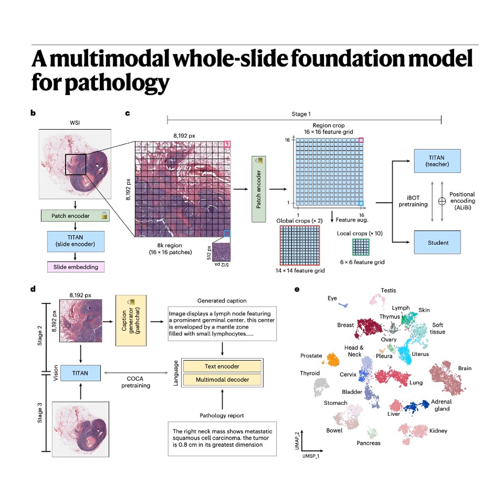Across a whole suite of subtyping tasks, Titan showed an average performance increase of plus 8.4% over the next best model. In clinical AI, that is a massive jump. It really is. But the most important area is that low data regime, the few-shot learning. Remember those rare cancers where you might only have one or two examples? Titan showed superior data efficiency. It's a direct result of its robust pre-training.